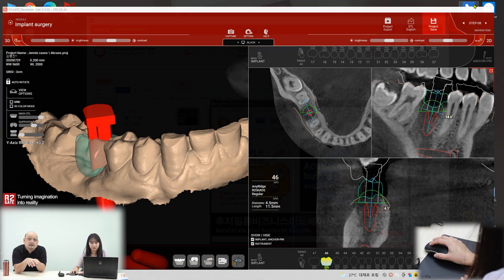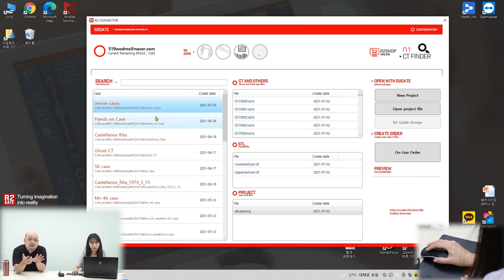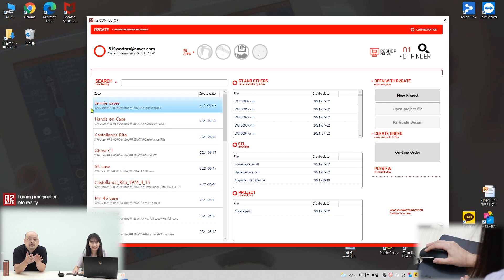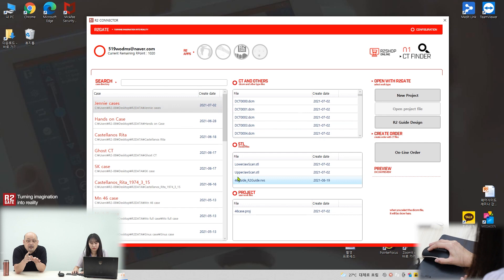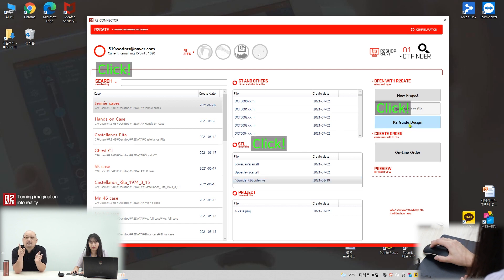Close the update and look at the patient portal. If we click the portal, there will be an RWS file — you can see it there. Click that file and the R2 guide design button will be activated. Then click to proceed.